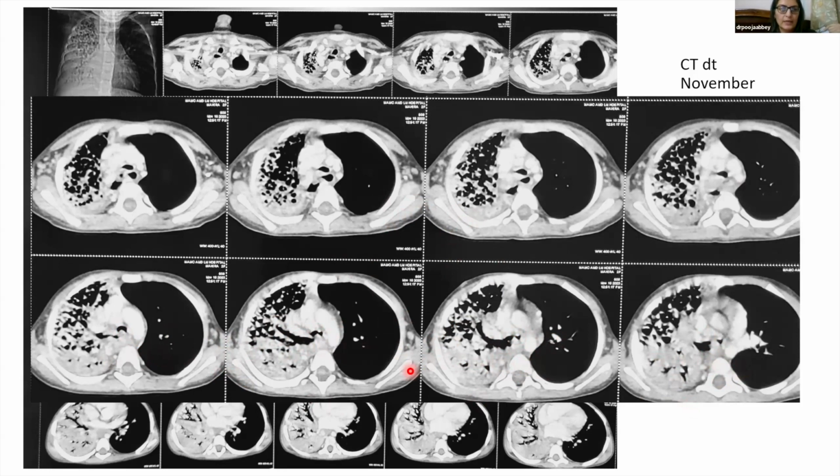So then the clinical colleagues, our pulmonologists, went ahead with another bronchoscopy. This was bronchoscopy number 3 now. What they found was a foreign body in the right main bronchus at its lateral edge, which was actually embedded. And there was a lot of granulation tissue around it. And that is what was happening. They tried to remove it. Multiple attempts were made using a Dormia basket and a tooth forceps, but they could not remove it.